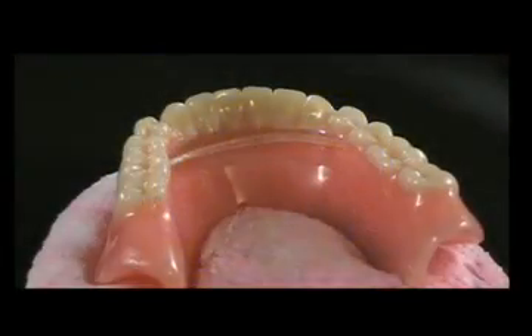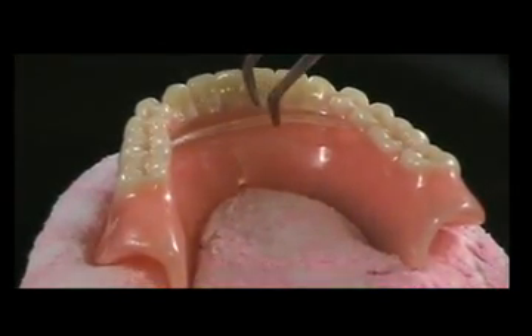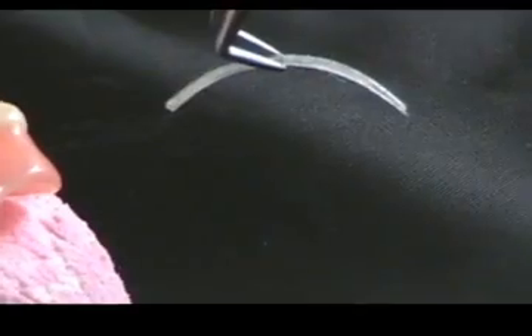Use a handheld light to cure the E-fiber. If necessary, the light-cured fiber may be removed and adjusted with an acrylic burr.